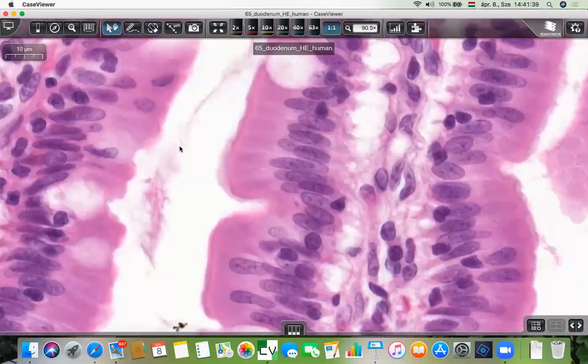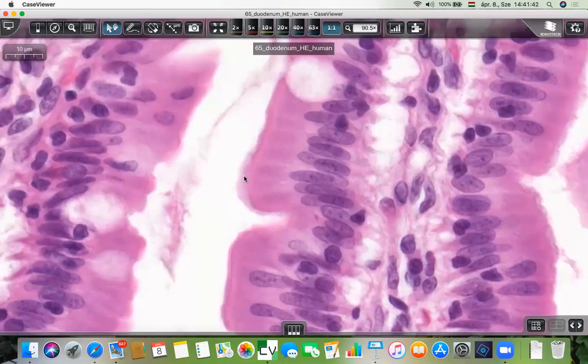And look at the opposite side: there is a silhouette of a mass of microvilli. So we can see the smallest surface increasing structures. The simple columnar cells bear another name, enterocytes. Enterocytes line the entire surface of the intestines, from the small to the large intestine.